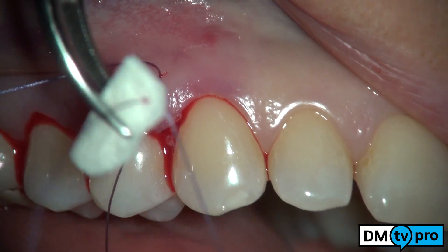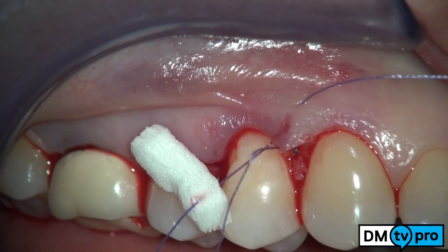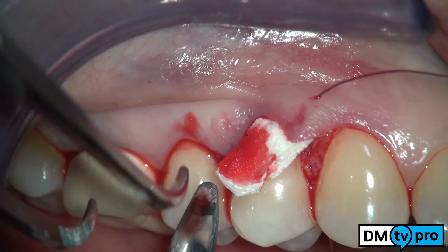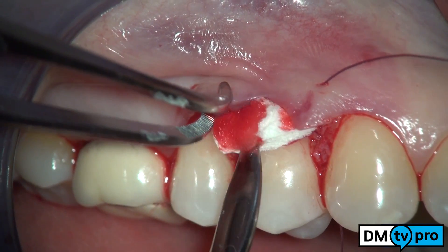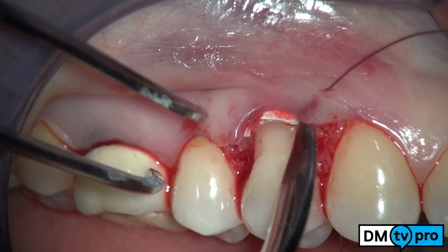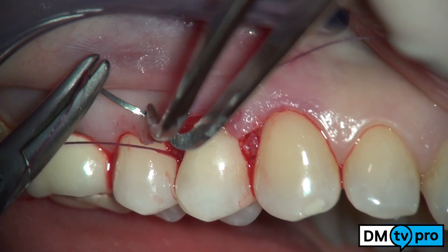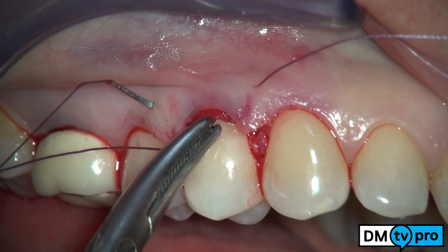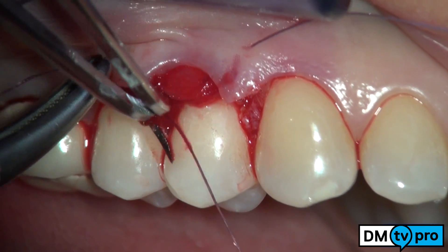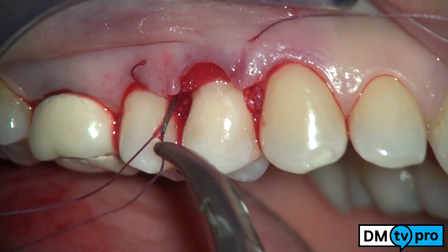A sling suture to the papillae is used to coronally advance the flap and to secure the collagen matrix at the same time. A 5-0 resorbable suture starts from the external to the internal side of the surgical papilla, then from the external to the internal side of the matrix, then again from the buccal to the palatal aspect of the mesial de-epithelialized papilla. The suture follows passing underneath the contact point at the opposite side, then enters the surgical papilla from its external to its internal portion, then passes through the matrix from the surface to the depth.